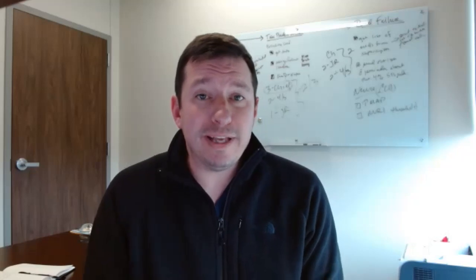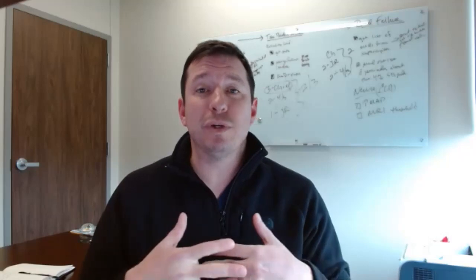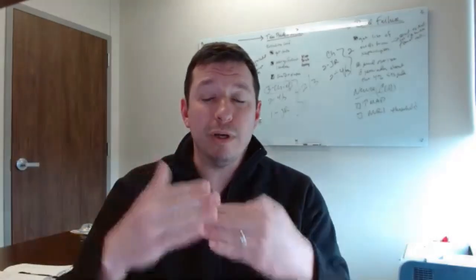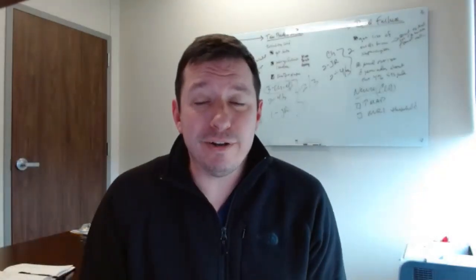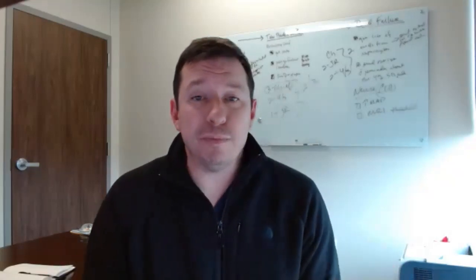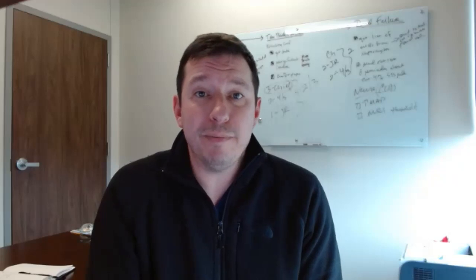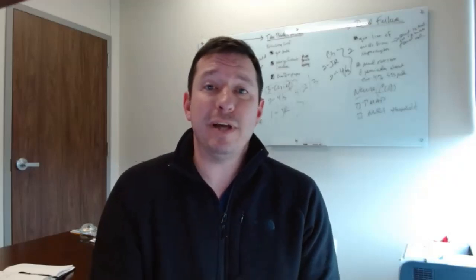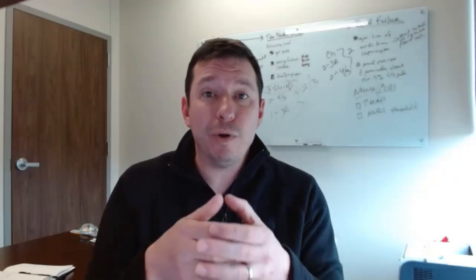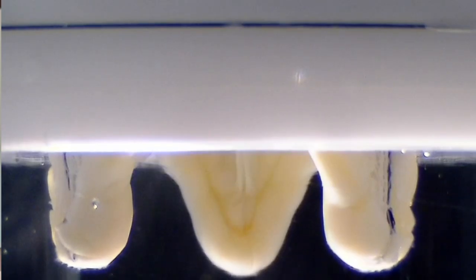And so some of the things that have occurred is, number one, they're very low profile. So instead of these really long arms, they've been really shortened. And the next thing is the material that they're made of, the framework itself, has become more flexible. So we can fold these flat, slip them in through that small rib space, and secure them back into the mitral valve area, just as if we had done a regular procedure. And then once we allow them to open, they spring open just like we would have it if we had done an old time open replacement.